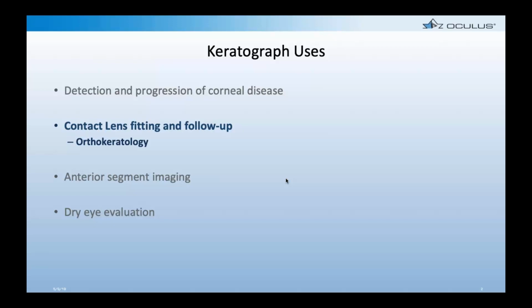You have lots of different settings for the photos to enhance the image and capture it from different perspectives with infrared or cobalt blue light. That's another great aspect of the Keratograph. And the dry eye evaluation is another bonus that this instrument brings that other topographers just don't have the same capability. But tonight, what we'll talk about more specifically is basic corneal topography, how we use that data for contact lens fitting and follow-up, and in particular, how it pertains to orthokeratology.